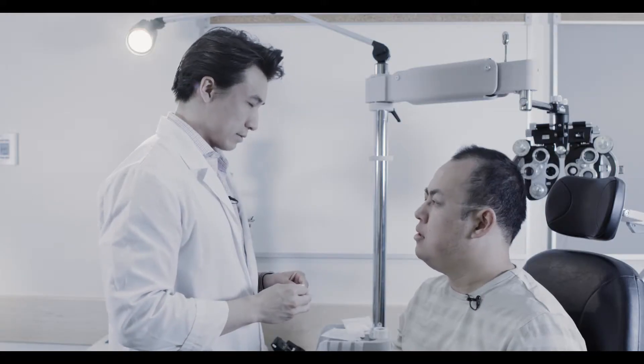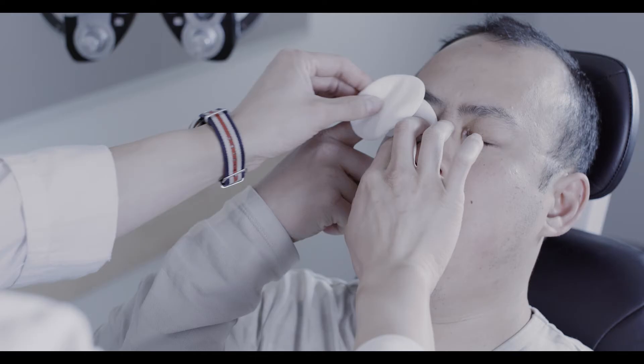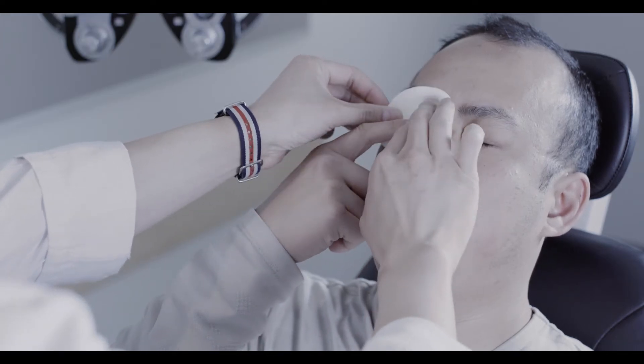Take the first eye pad and fold it in half. Place this onto the closed eye. Take the second eye pad and without folding it, place it over the first pad. At this point, have the patient assist you by holding the pads in place.